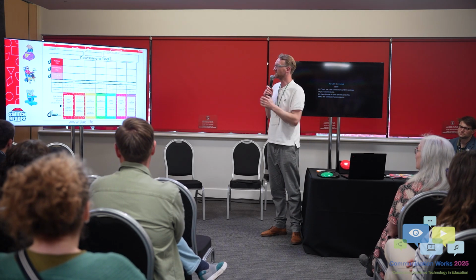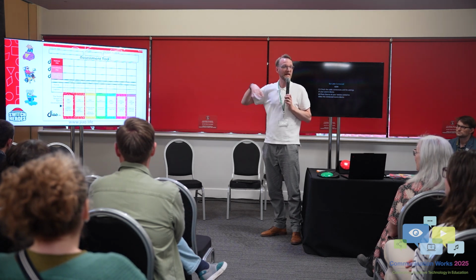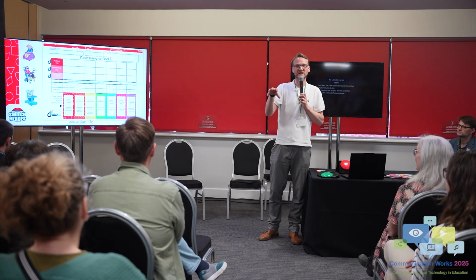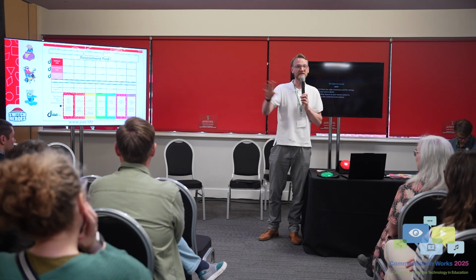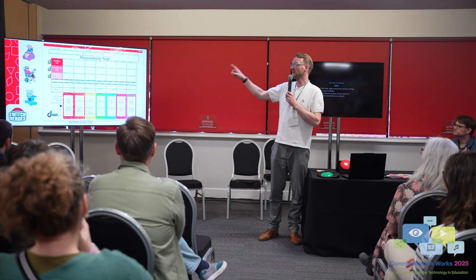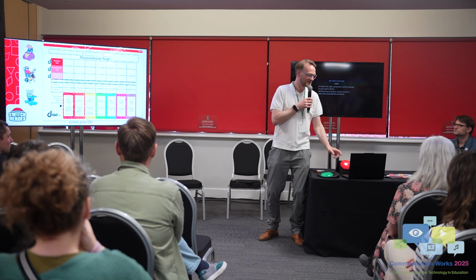And then there's an assessment tool. It's really good to keep track of a child's progression. I don't know if it's your experience, but often I find that children who have switch access, it's kind of dependent on which classroom or where they've gone, and there's no history. So there's a switch profile that you can download and use that helps, and then there's an assessment tool which gives families a bit of a trajectory of where they're going. So that was my world.